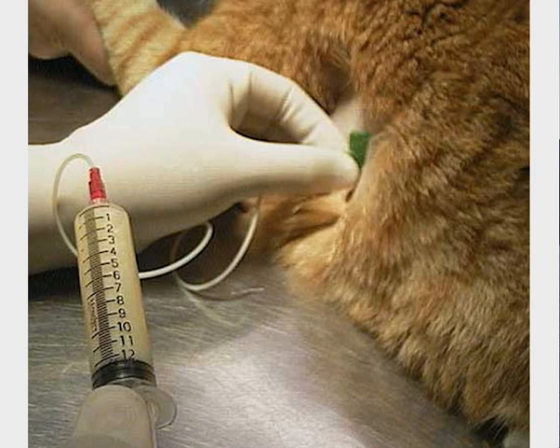One of the most important classifications for these fluids is total protein. We probably won't be dealing with specific gravity too much unless the total protein falls below 2 grams per deciliter. So for the most part, we'll be getting a total protein on these fluids. That will help us classify it as being a transudate or an exudate.